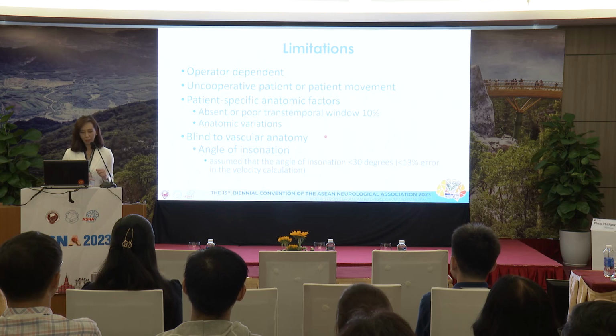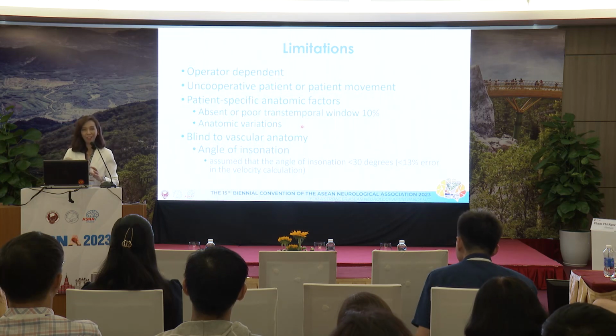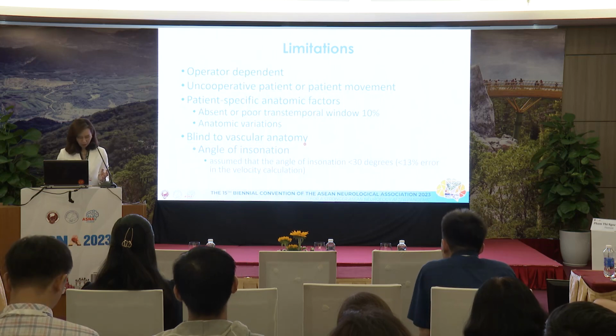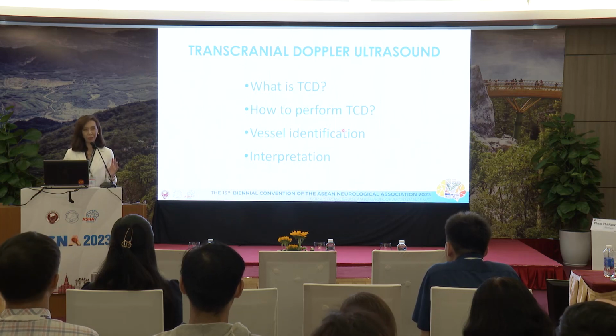As mentioned earlier, some older Asian ladies would have a bad temporal window. Maybe 10% of the patients we do TCD on, we won't be able to find a window. And because we don't see the anatomy, we just look blindly, so some variations we won't know about. And then the angle of insonation, we can't correct it because we don't know the anatomy.